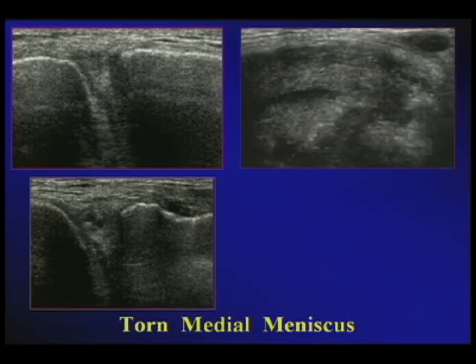Now, of course, just turn your transducer around, and from the short axis views, now on your right-hand side, you see the long axis view of a meniscus. You begin to appreciate that the anterior portion is relatively intact, as seen by this red line, and that when I go to the posterior portion with a yellow line, you get to see what we saw earlier on the short axis view, which is the lower left-hand image.